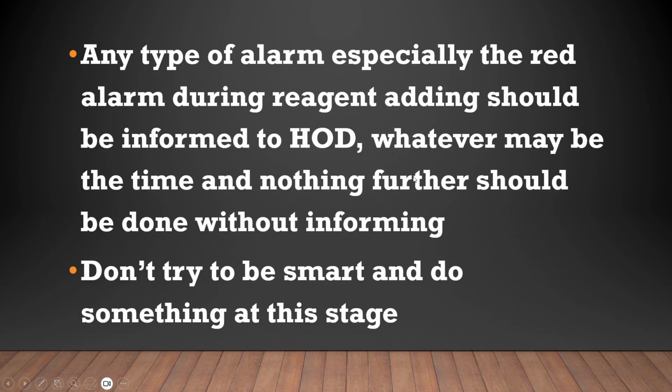Now during this whole procedure, if any type of red alarm or any such problem develops, please always call me. Don't try to do anything heroic. You may have to take some photos and other things to inform me whether I can handle the situation through phone, or whether I need to come and actually correct it. Please also remember that reagent adding, reagent removal, and all those things are always done in the night time only. We don't do it in daytime, so that the patient sampling and all will never suffer.